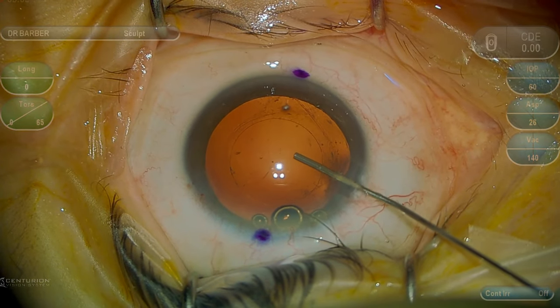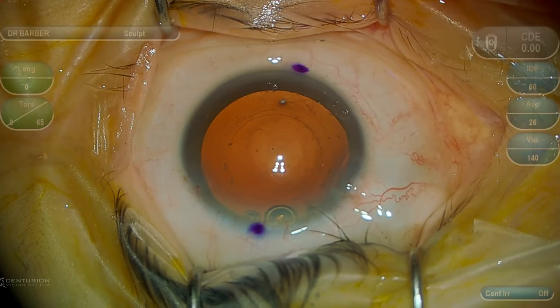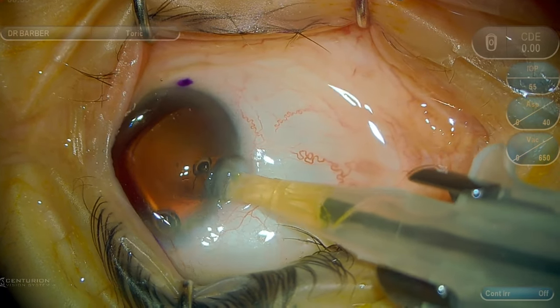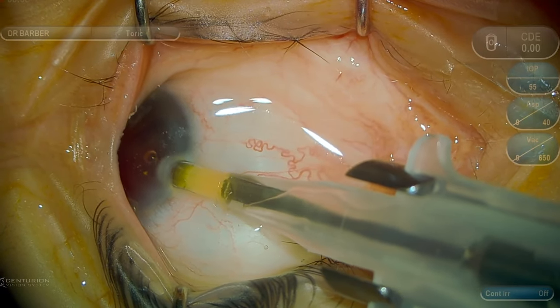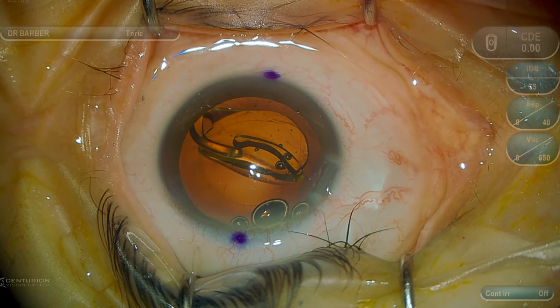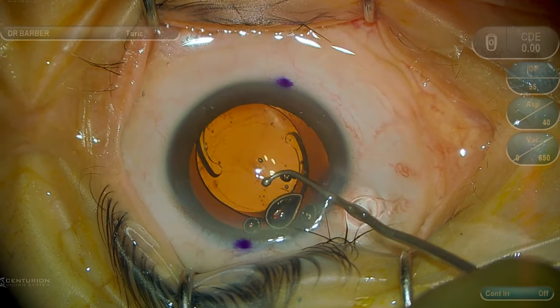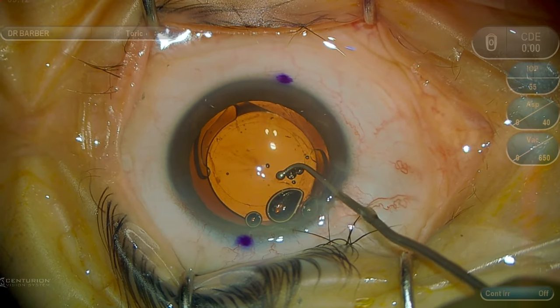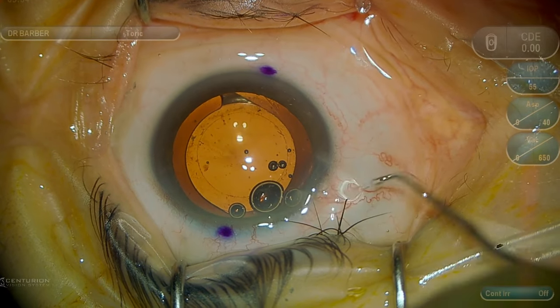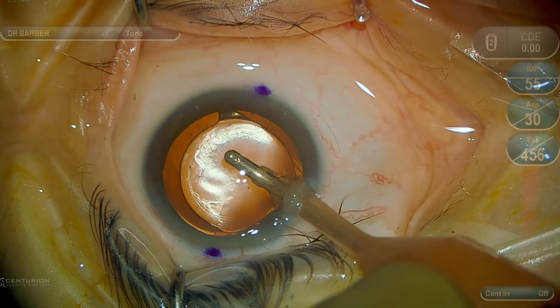The capsule is now inspected and filled with a cohesive viscoelastic. The new lens implant is carefully inserted back into the capsular bag. In this particular case, there was a clockwise rotation of the toric lens, and so based on the stable postoperative refraction, it was determined that the lens should be placed 15 degrees counterclockwise from the initial implantation axis. Viscoelastic is now removed and we have our new lens implant carefully centered and properly positioned within the capsular bag.